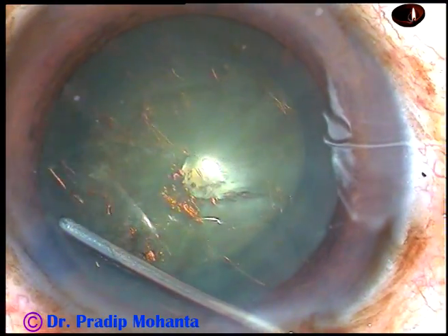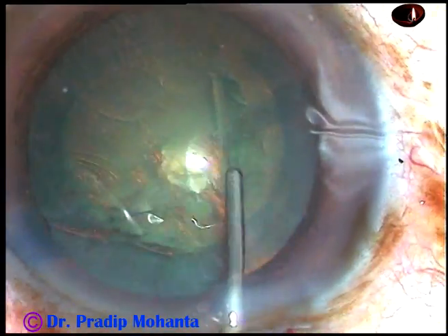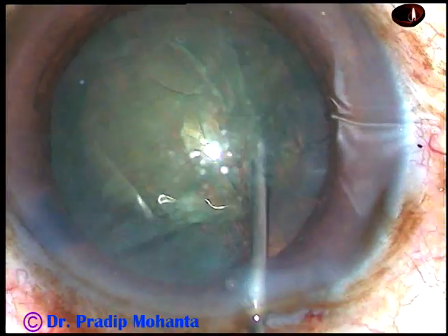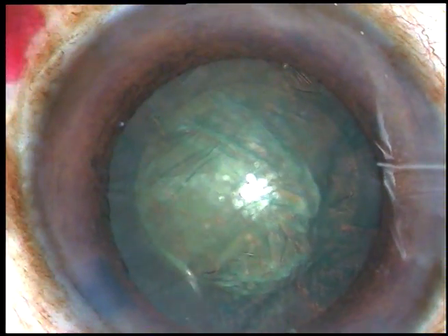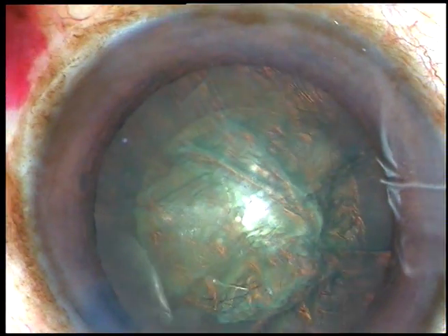Now hydrodissection. The fluid wave has gone to the opposite equator and the nucleus is mobilized. The nucleus is rotated, and now some more viscoelastic substance is injected.